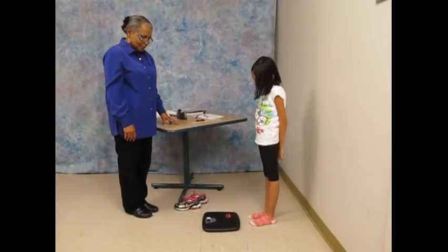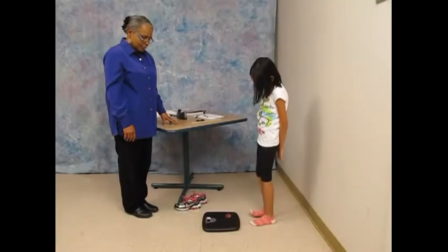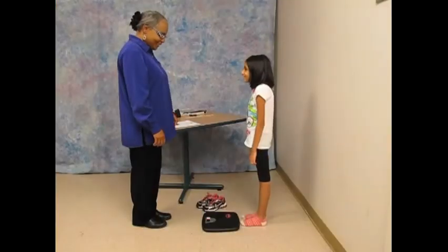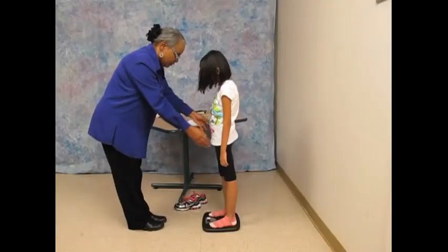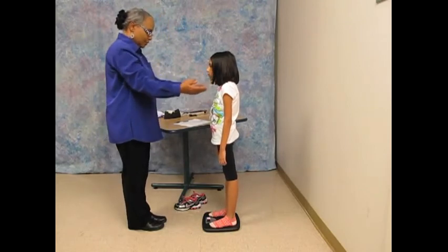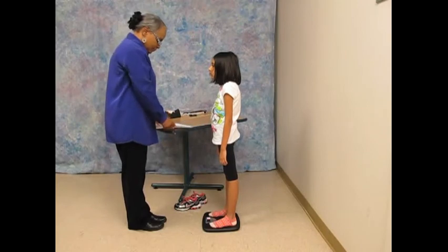Now ask your child to tap the lower right corner of the scale 2 times with their toe. When you see the 0.0 display, ask them to step onto the scale. Both feet should be centered and facing forward. Make sure they are standing still, arms at their side, and they are looking straight ahead. Have your measurement form and pen ready.